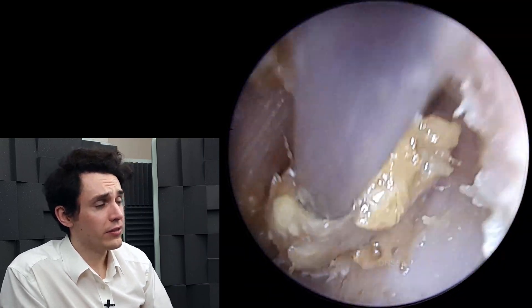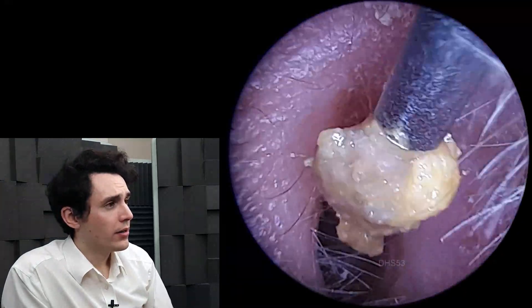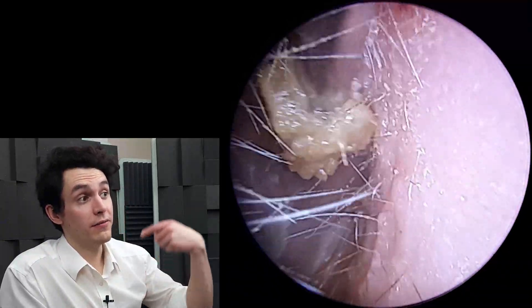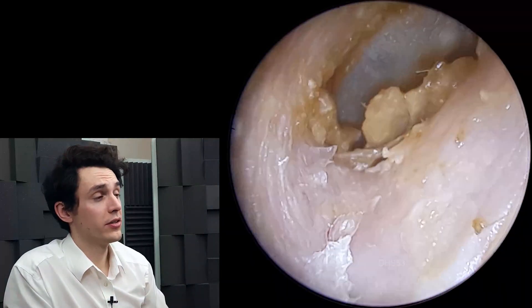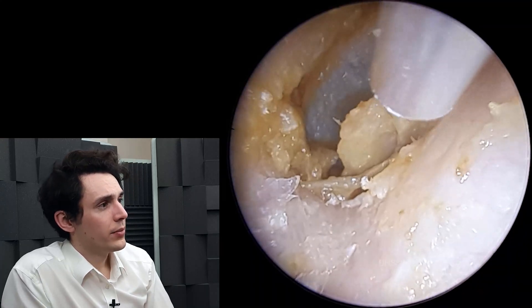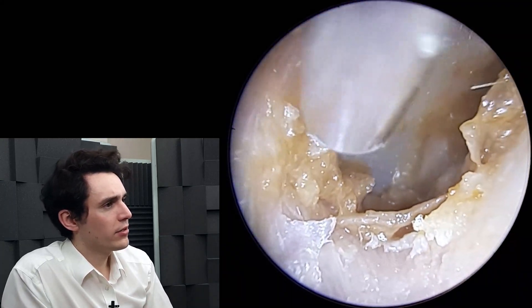But you can tell the difference if you've seen enough ears. So here we are just breaking apart these very small chunks of wax. For the most part, everything does eventually draw through the suction probe — even when I exit the ear, it ends up popping through the suction probe, so there's not a huge amount to see on the tissue. But just here, we're going to grab this little piece and slowly free up the eardrum.